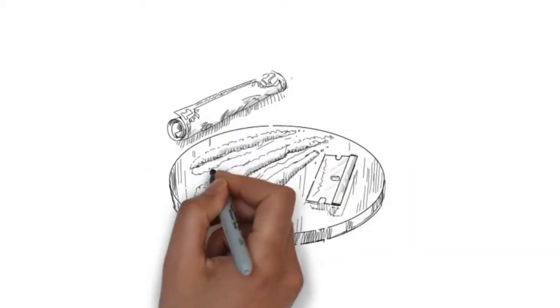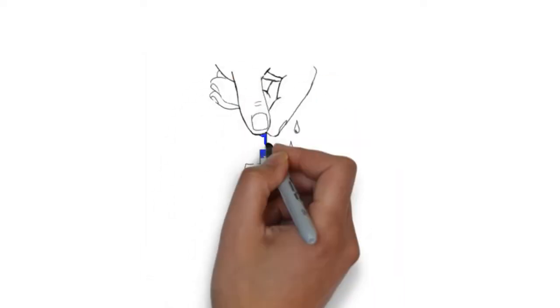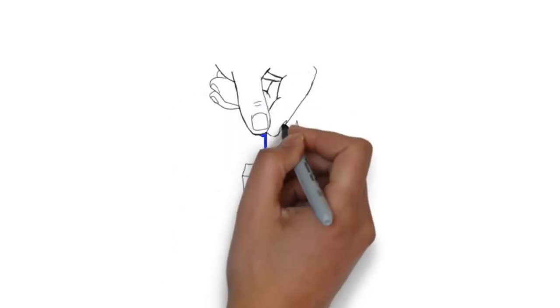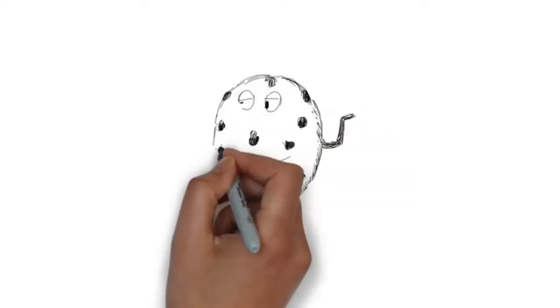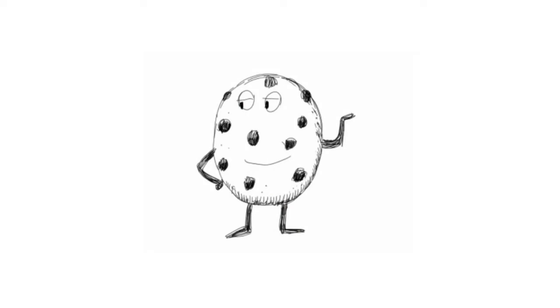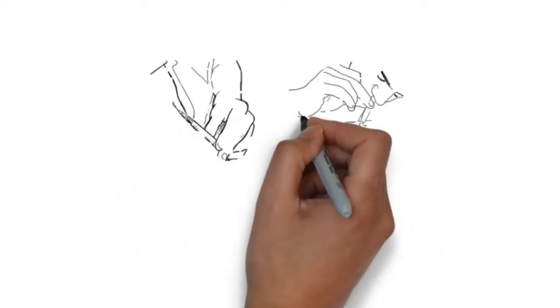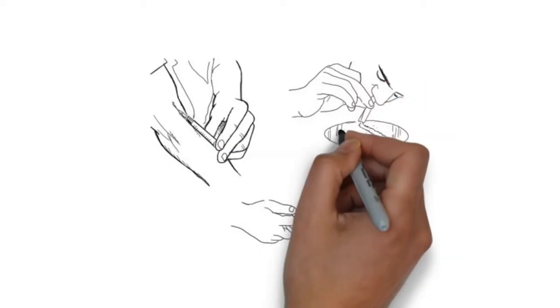If you're not an injector but sniff your drugs, you can empty the contents of your baggie and add a little water to the empty bag and test the residue that way. If pills are your thing, you'll want to crush and mix them first. Fentanyl does something called chocolate chipping. When pressed into a pill, it tends to bind to itself, so you'll want to mix them first to get the best results. After testing, you can snort it, shoot it, or mix it into a beverage and drink it.